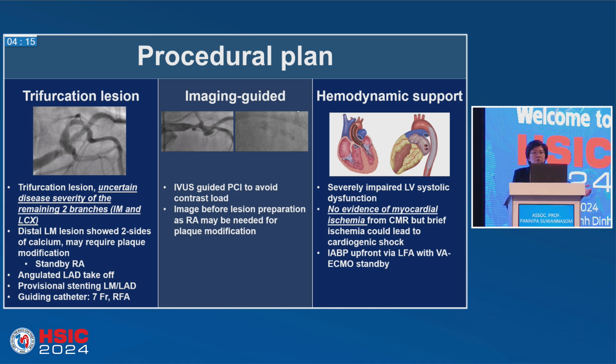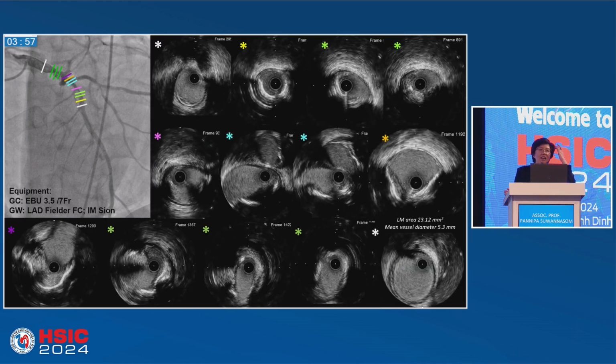Of course, it's going to be imaging guided and with hemodynamic support, because we don't have Impella in Thailand, so you only have ECMO or IABP. The surgeon said, okay, no problem, my sister. I will have a VA ECMO standby for you. So if you need any help, just scream. Okay, so let's see the pre-procedure.